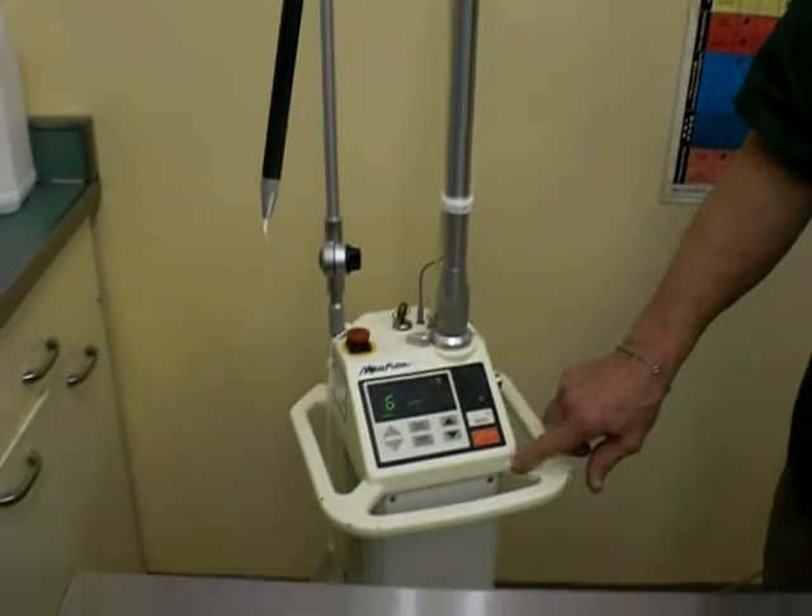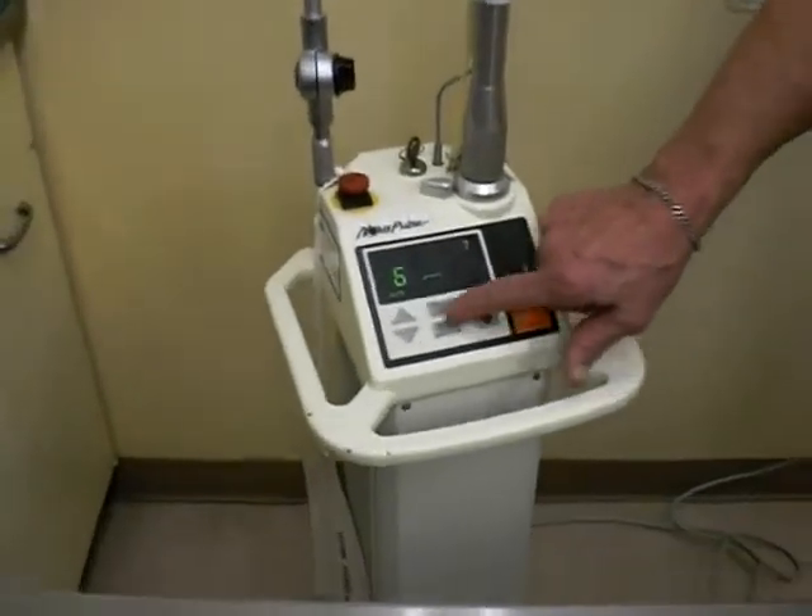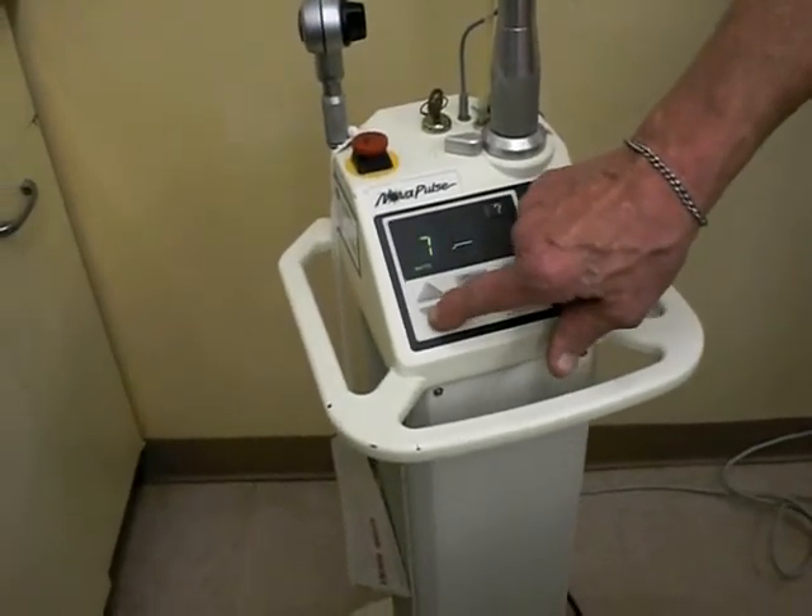This incision can be as shallow or as deep as we might want it to be, and this is controlled by the power density output of the laser. There are some buttons on here which allow me to change settings, and I can increase the power or I can decrease the power.